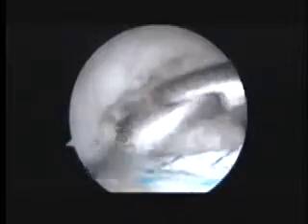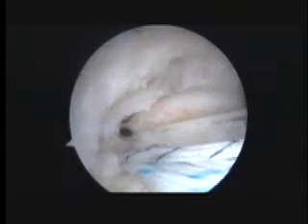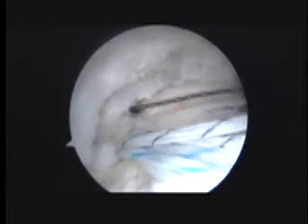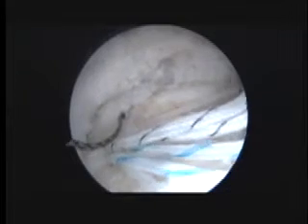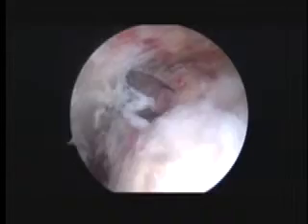Come back to... push down and make sure we get through all that, just like that, and remove a little bit more of these bone fragments. Okay, now we're going to go ahead and feed that wire through, and then outside your shoulder, we're going to load that with a stitch. And as we pull back, you'll see the white suture come with it. There it is coming through.